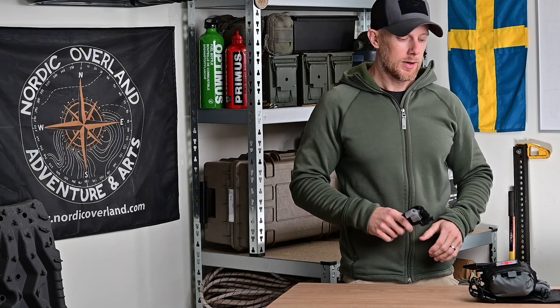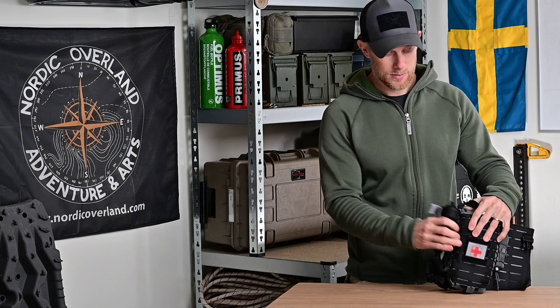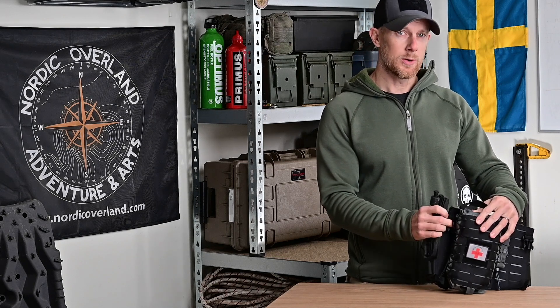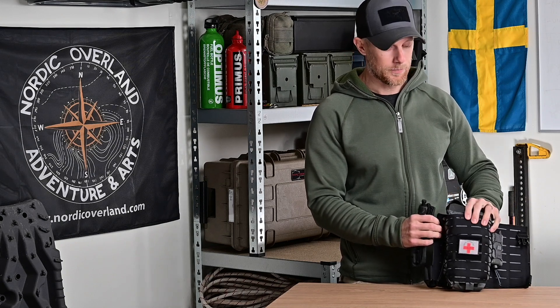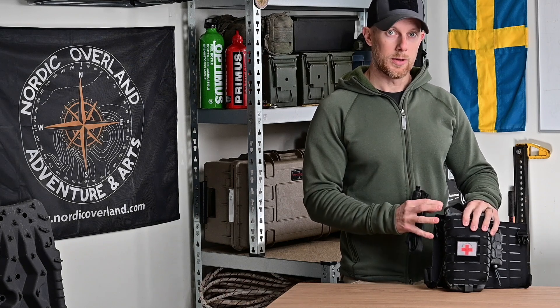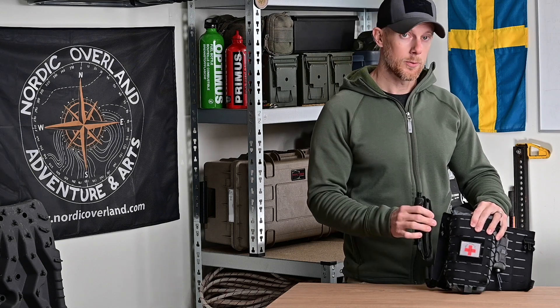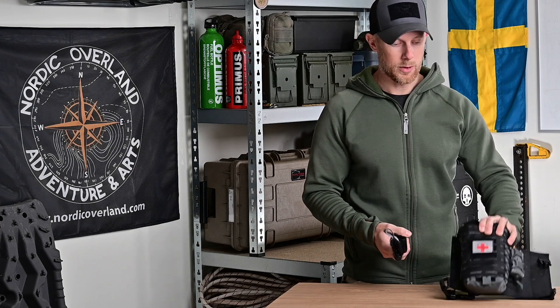Som en bonus kan jag fästa en toniké i de elastiska banden på traumakittet, vilket ger lite snabbare och lättare åtkomst än att behöva dra ur slädden och öppna fickan. Nästa version av kittet kommer se lite annorlunda ut men man kommer fortfarande kunna fästa en toniké i elastiska band på utsidan. Nackdelen är att den blir mer utsatt för smuts, fukt, väta och lera när man kör.